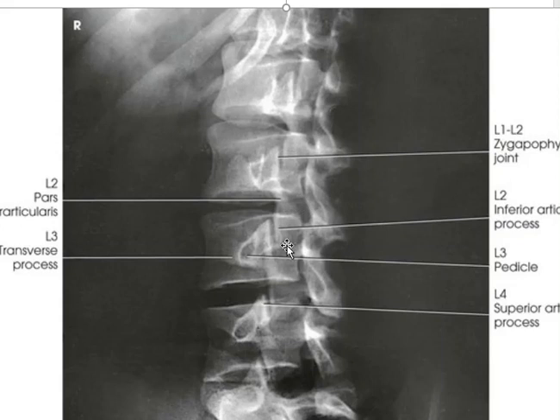So what we're looking for is the zygapophyseal joint. What we want to use to determine our obliquity is where is the nose. So the eye is the pedicle. You're looking straight down onto the pedicle. The superior and inferior articular processes make up your zygapophyseal joint. So the ear is basically the superior articular process, as opposed to the front leg being the inferior articular process.